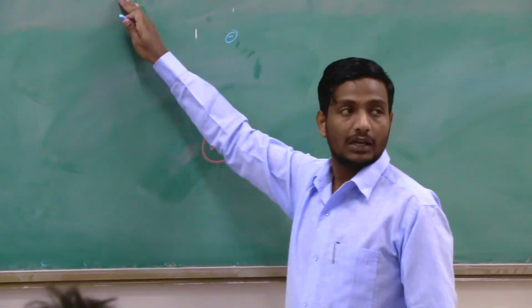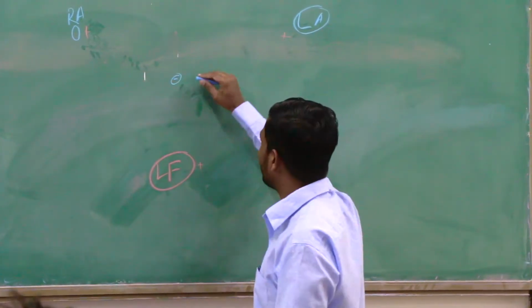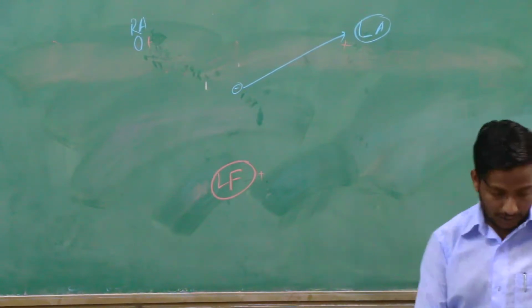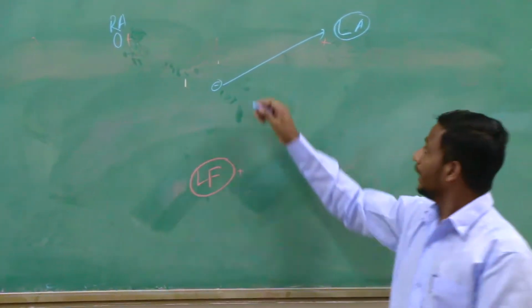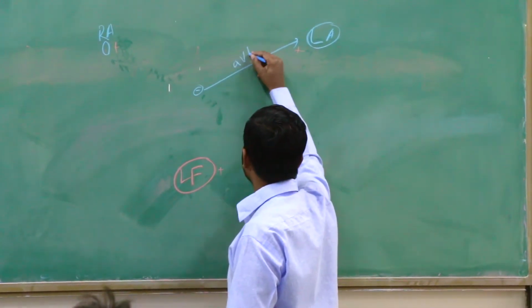So, if I have to put together the axes of the leads produced by these electrodes, then I can say that from the center of your body, one axis will go to the left arm, right? From the center of the body to the left arm, and this one we are going to call aVL.